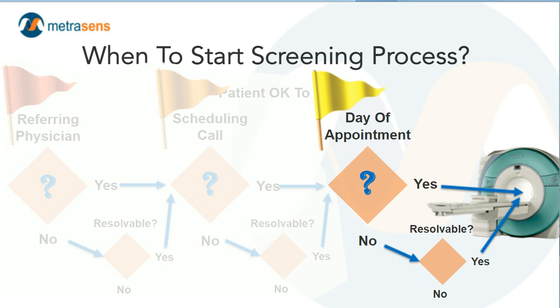But whatever is left on the day of the study ideally should be either a no-brainer immediate resolution, or something entirely within the technologist or radiographer's control to make whatever modifications need to be made to allow the study to go forward.